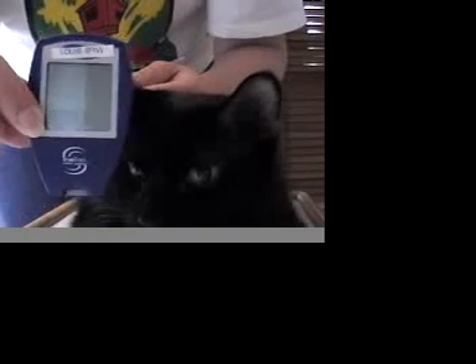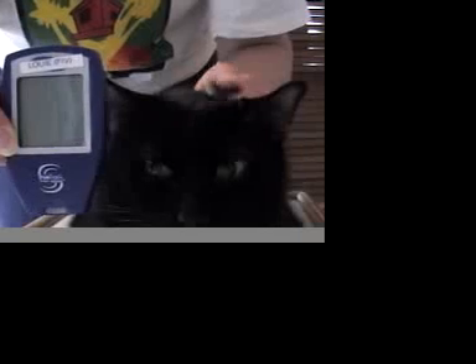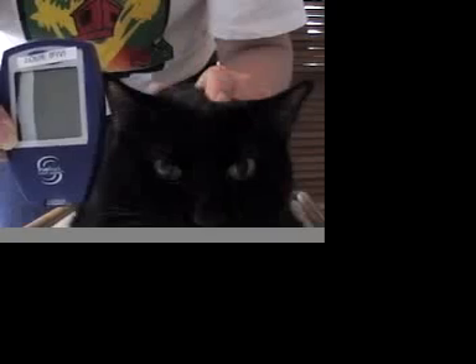I have all our supplies here. I use the TrueTrack meter — it's a meter made for people. I like it because it doesn't use a huge amount of blood; it uses one microliter. You can get meters that use less, and there are also meters that use a lot more. It has strips that sip the blood, which makes things a lot easier rather than strips that you have to drop the blood into a hole.